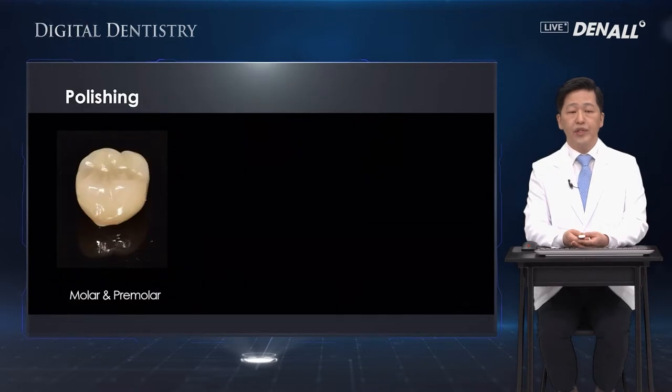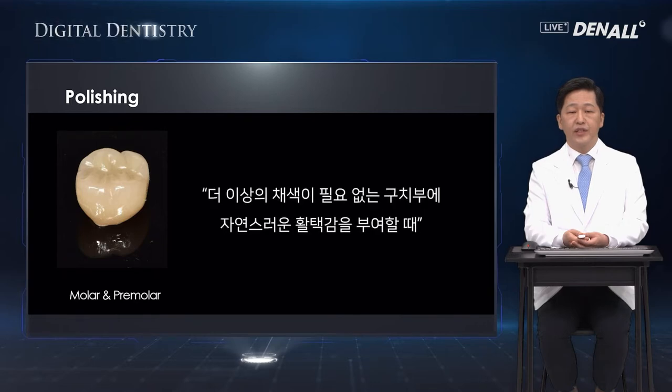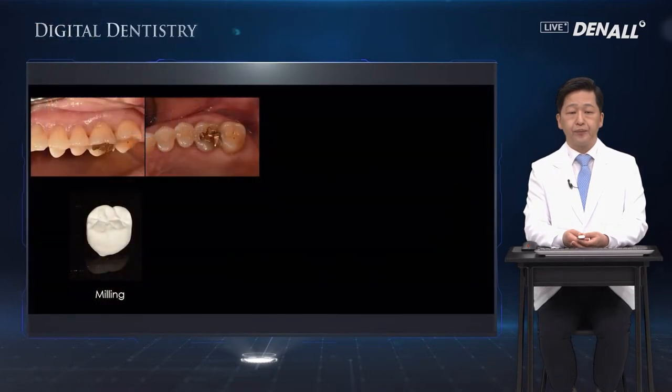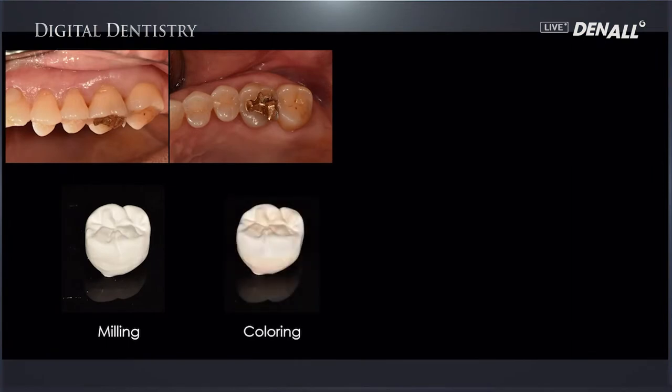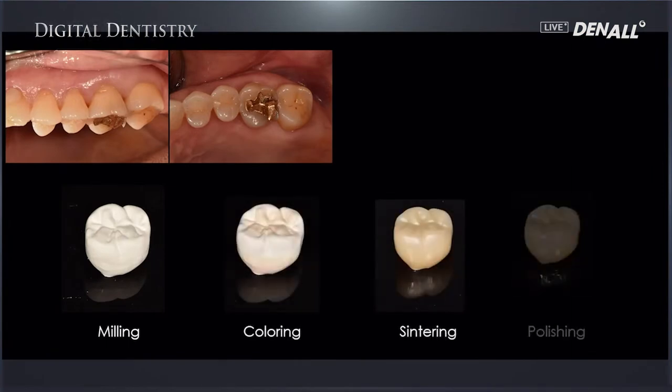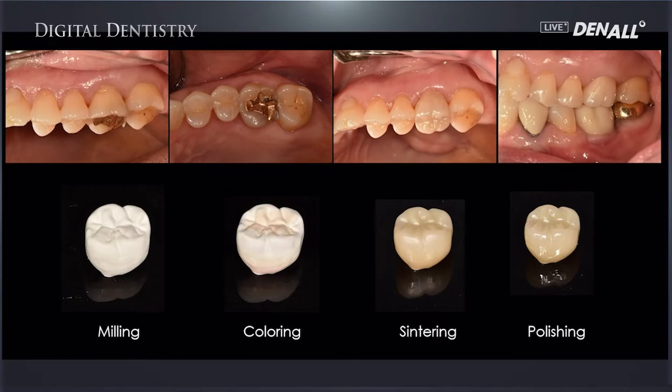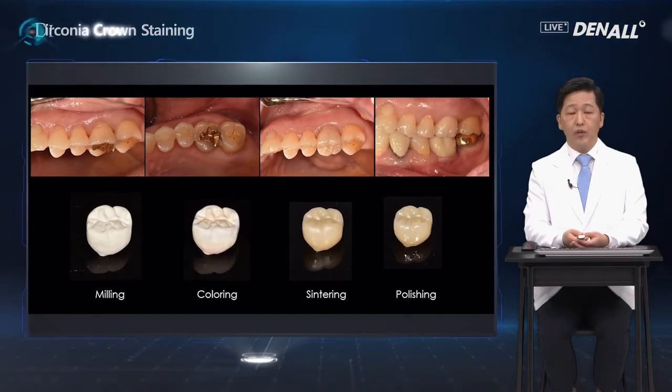For molars, polishing is used to provide natural smoothening on the posterior teeth that do not require any more coloring. There are many different types of polishing tools: the pointed ones, the feather type, and the wheel type. After milling, coloring is done, followed by sintering, and then the surface is polished and delivered in the mouth. Let's have a look at the process of polishing using a video.